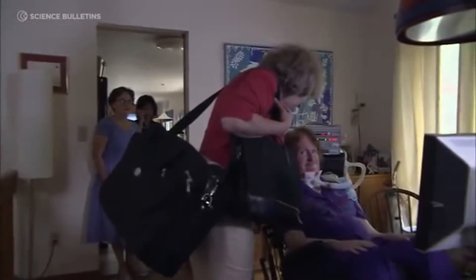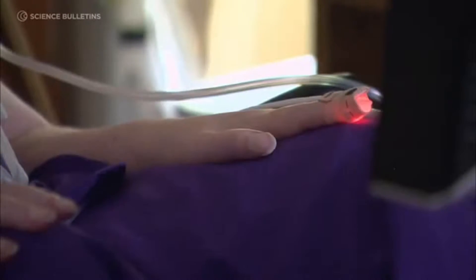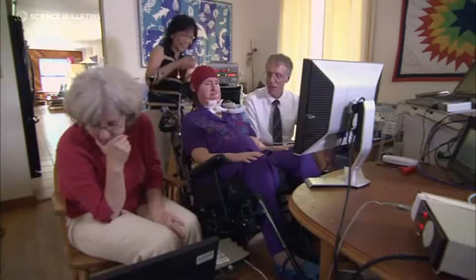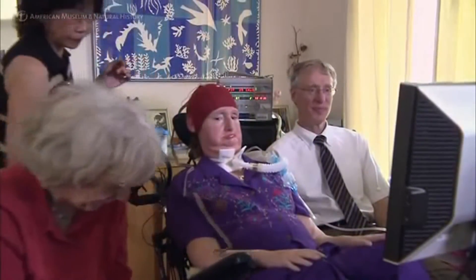Kathy Wolfe is a patient with ALS, or Lou Gehrig's disease, and she's one of the people participating in our group's effort to develop brain-computer interface systems for people who are very disabled — people who haven't just lost the use of their arms or legs, but may not be able to speak, may not be able to breathe, may not even be able to move their eyes very well. They can live for long periods, but they can lose their ability to communicate effectively with others, and this is a tremendous loss.